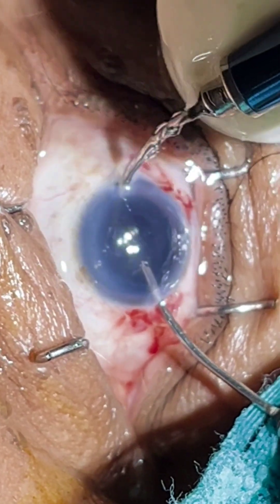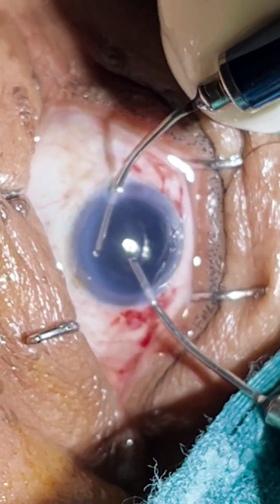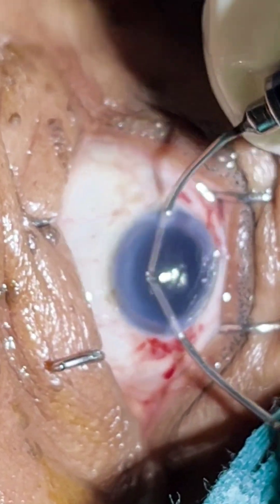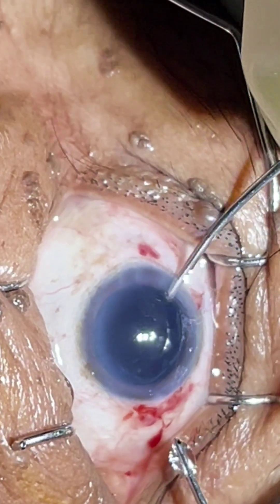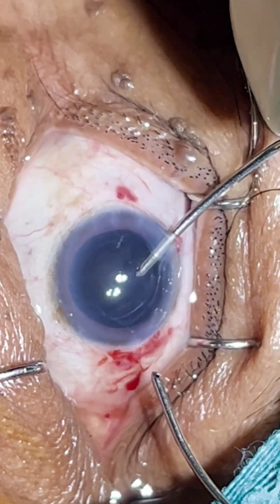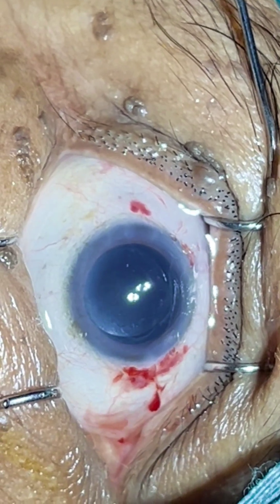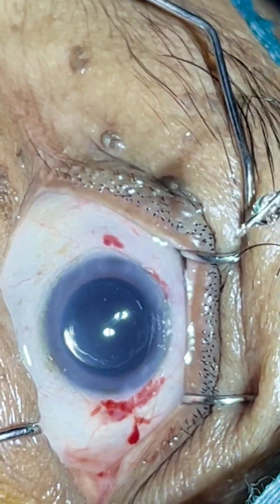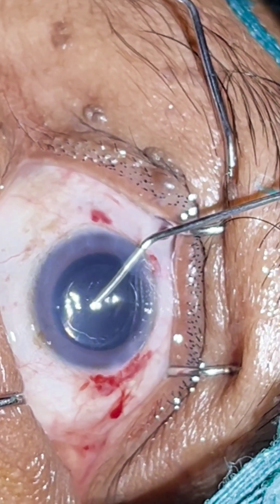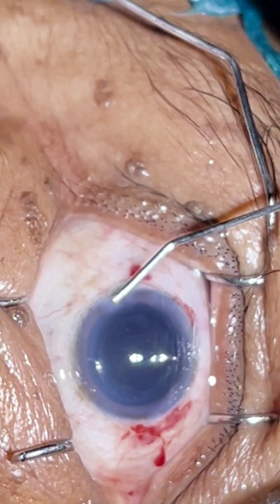So this completes the facoemulsification cataract surgery under topical anesthesia in case of an immature cataract. I am just hydrating the side ports here.